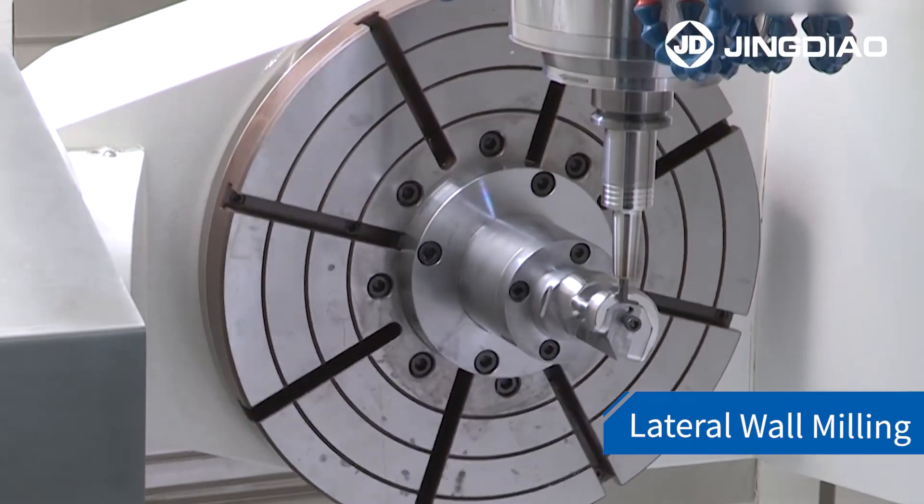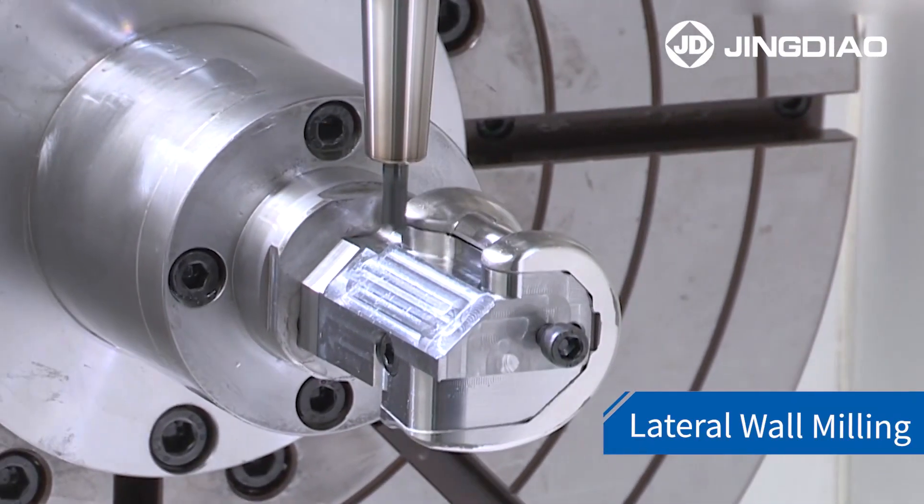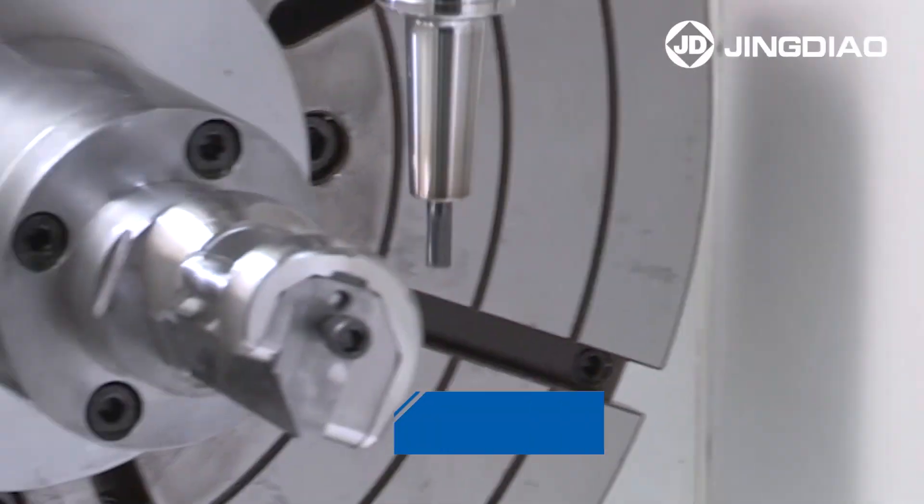Let's see how the JingDiao GRA400 achieves highly efficient machining of the femoral condylar processes.